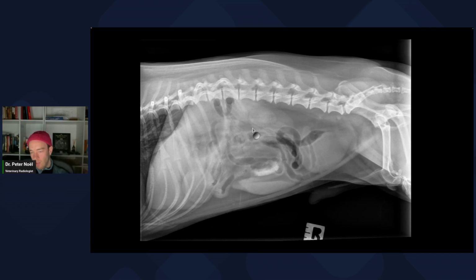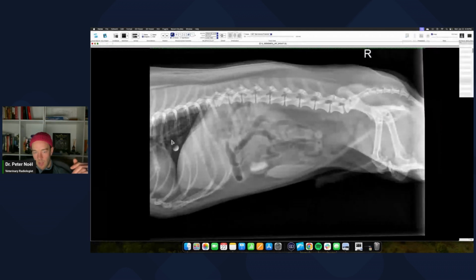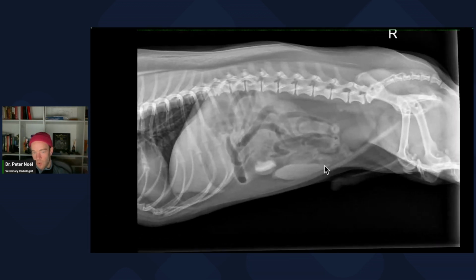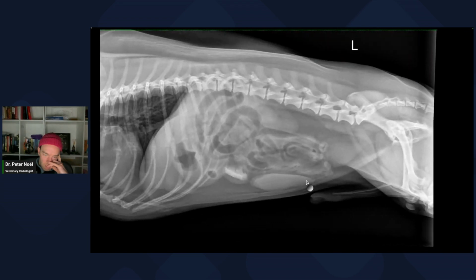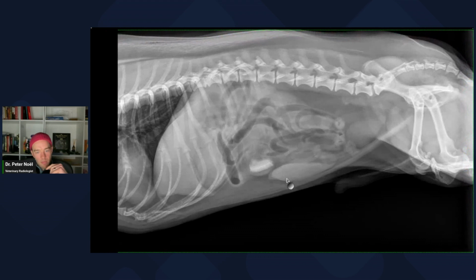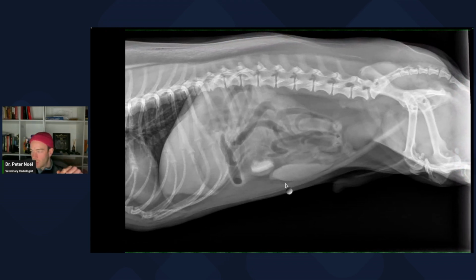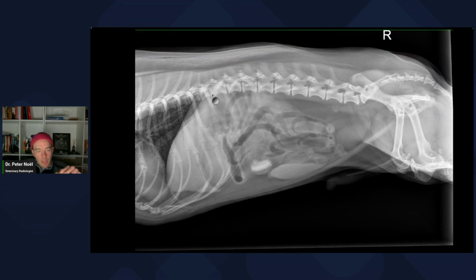So this dog should be cut. I don't think it was wrong for them to try supportive care because the degree of small intestinal dilation in this case is quite small. I think there's a loss of serosal detail right here. And so it's subtle. I don't really see it on that view. It just seemed kind of wispy right in here. And I guess I wouldn't be surprised if the fat surrounding that loop was a bit angry. Dog got subcutaneous fluids. 13, 12, 11, 11, 12 right here is mineralized.